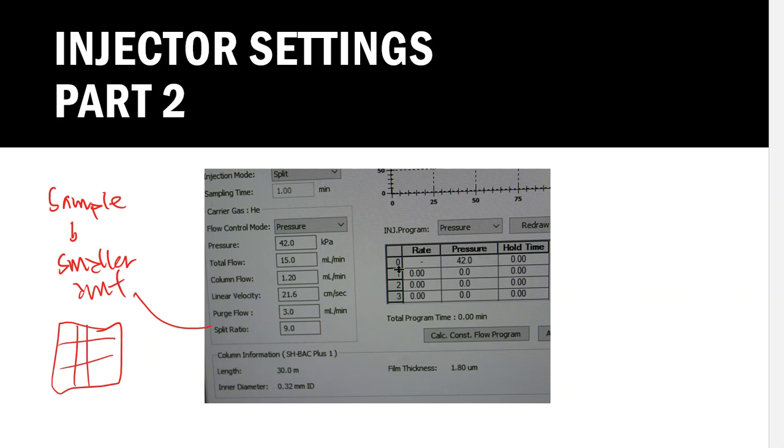So if that split ratio is set at 100, then that means we've taken the sample in 100 equal parts and only injected one of those 100 equal parts. So a super, super tiny amount goes inside of the machine and begins to get analyzed. And here we're working with gas. So all of a sudden, this gas plug is not a lot of sample, actually, if you think about that. When we inject that sample amount of gas, 1/9 of it will actually go through and get analyzed. And the other 8 parts are just wasted and shot out of the machine.